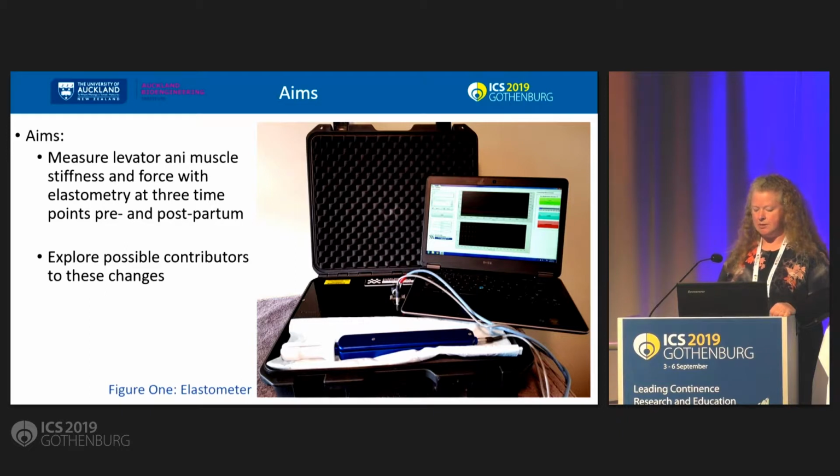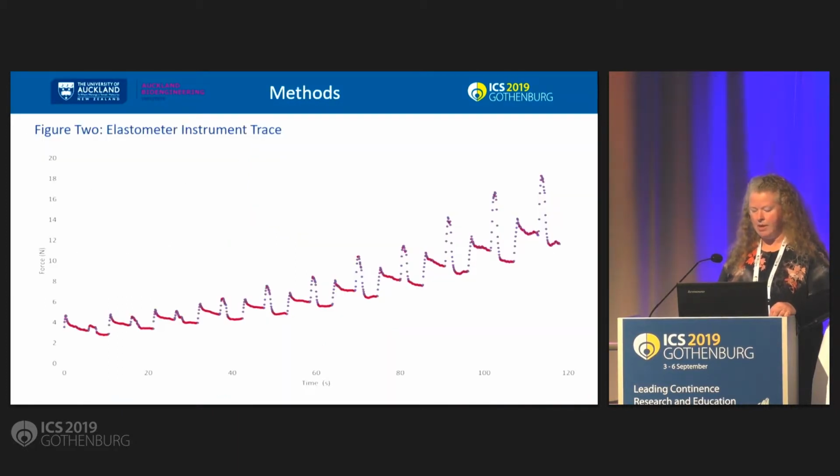It has step phases of opening which are controlled by a linear DC servo motor with a handpiece communicating with a laptop running LabVIEW. The instrument trace is visible in real time and shows the opening of the speculum from 30 to 50 millimetres at a sampling rate of 100 hertz.